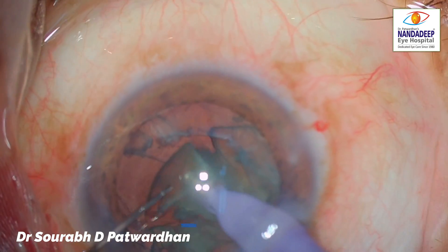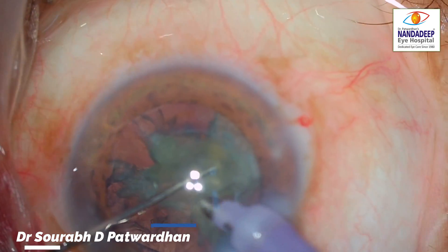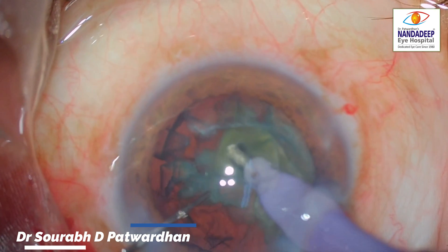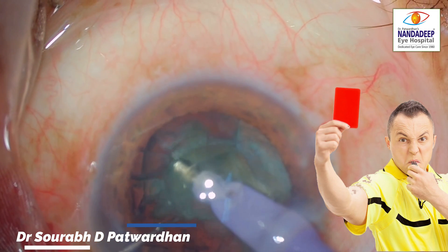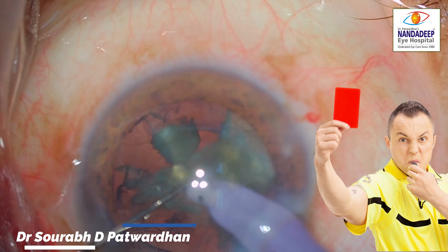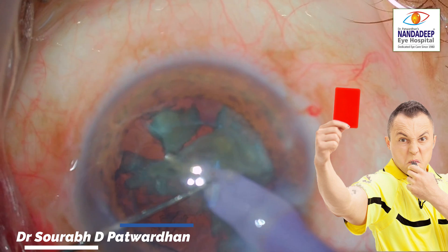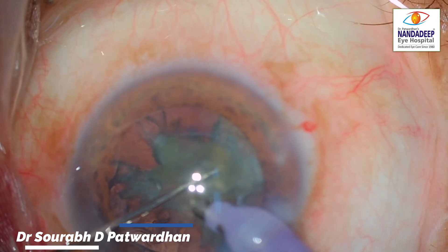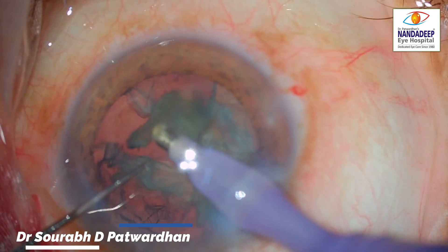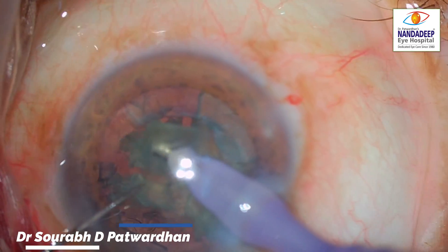Again, watch out for the feco tip — it reaches the danger zone and goes outside the safety limit. In all his previous attempts he did not create any complication, but now you can see he has punched through the posterior capsule. However, he misses this important observation and continues to do phaco emulsification, with the tip still not in the safe zone.